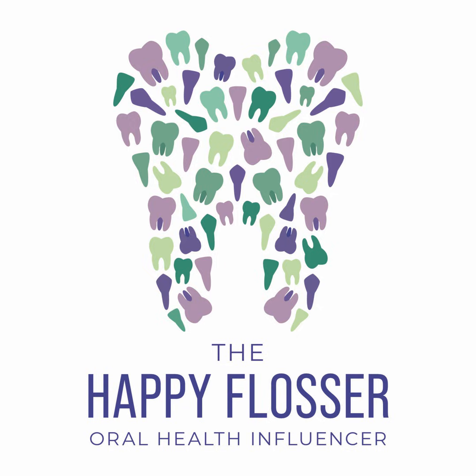Dexter doesn't have any feelings. There's no gag reflex, there's no tongue, there's no mandibular tori. There's a lot of things missing with Dexter. But one of the great things about Dexter is that you can get your technique really solid when you're working on Dexter to really hone in on your skills of taking great radiographs.